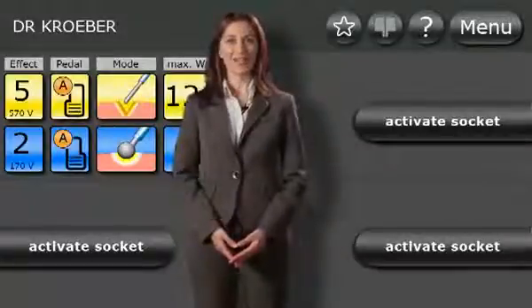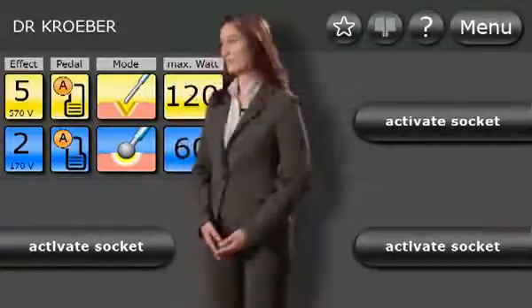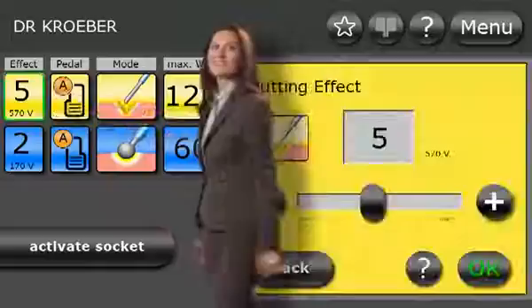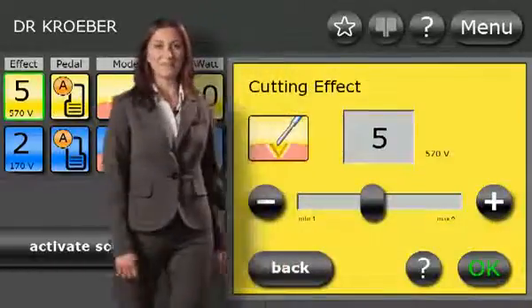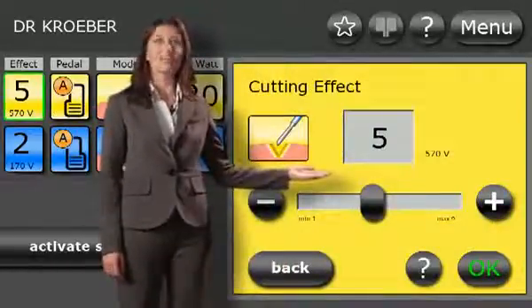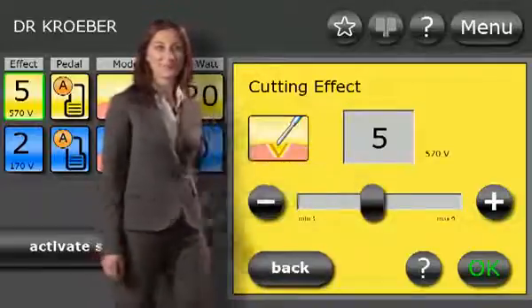This button is used to select the effect. When changing the effect setting, a preview of the expected changes with regard to the tissue is shown.